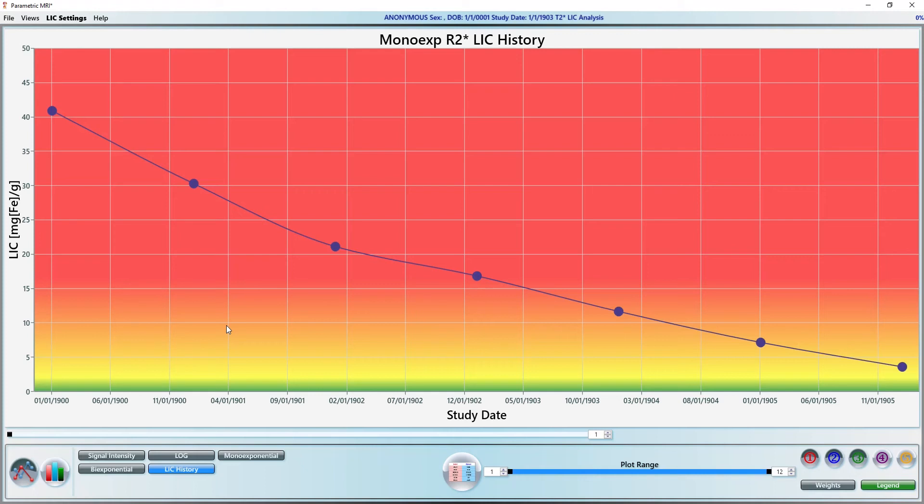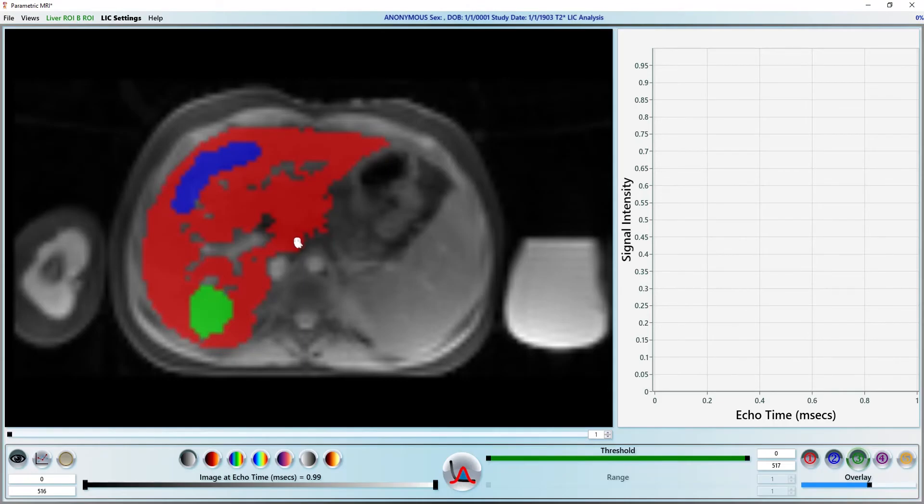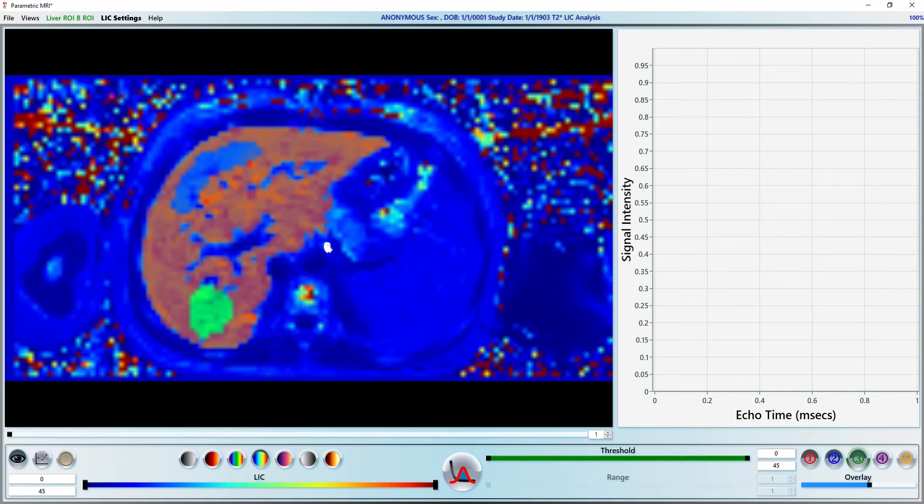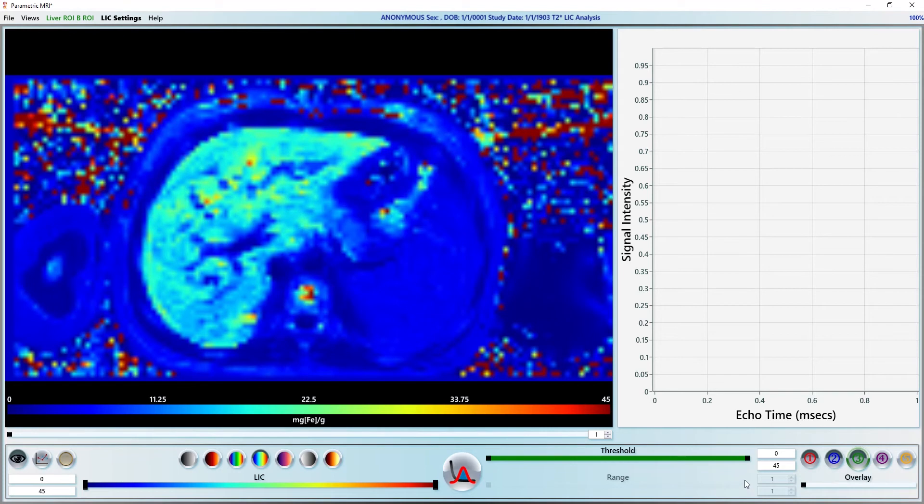Let's go back to the analysis page and make an LIC map by right clicking on the image and selecting LIC. Press C to bring up the color bar and turn off the ROI overlays by dragging the overlay slider down to zero.